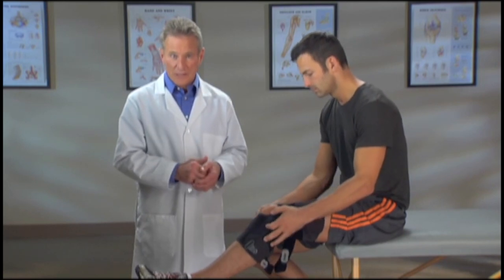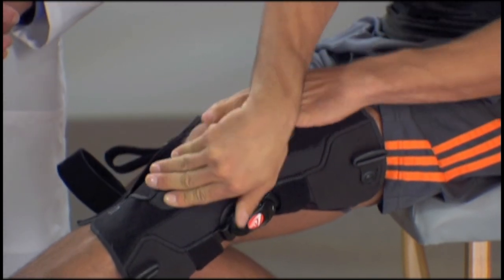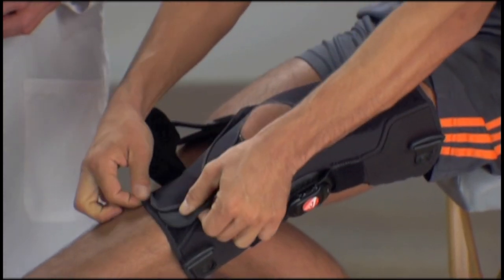As you go through the application process, make sure each strap is tightened to fit the knee snugly but comfortably. Pull strap two across the shin below the knee and fasten it securely. Pull tab three across the lower shin.